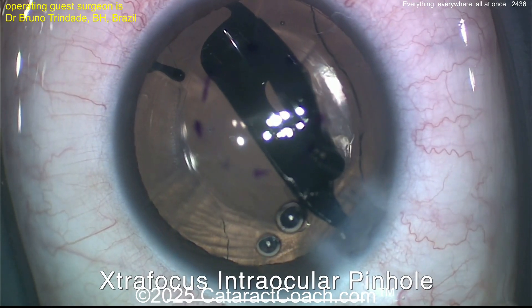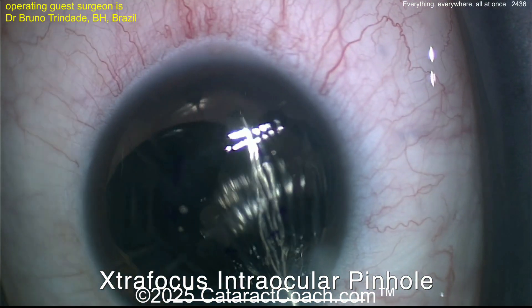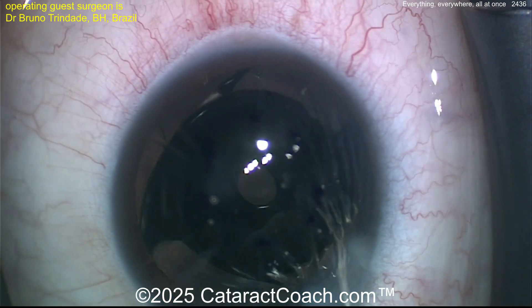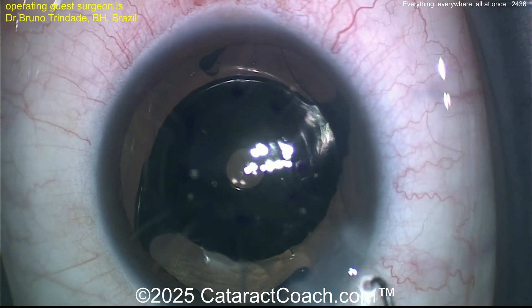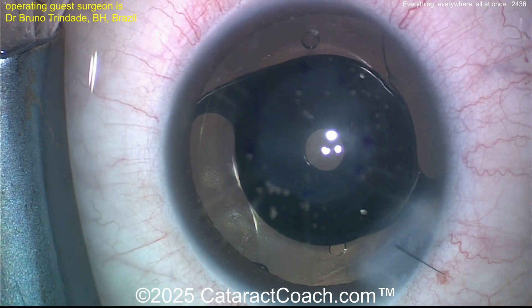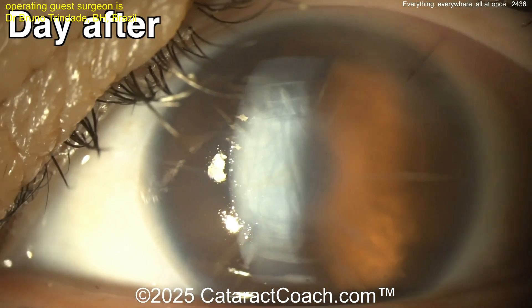Here's the extra focus implant — this is a pinhole implant that was designed by Bruno Tandrés's brother Claudio Tandrés, both from Belo Horizonte, Brazil. You can see this is a great implant because you can use it with any existing IOL well, and you can go in the bag — which means you now have two lenses in the bag.